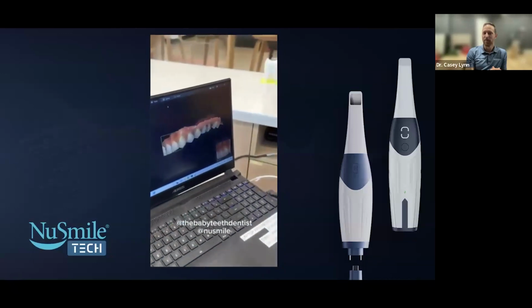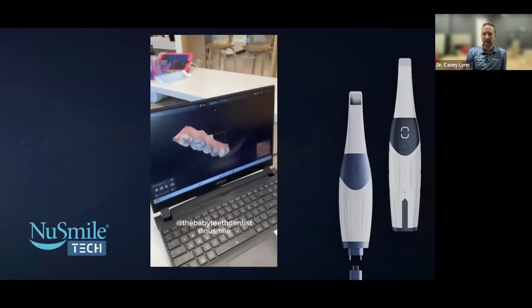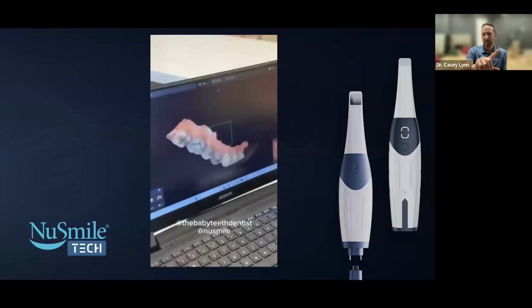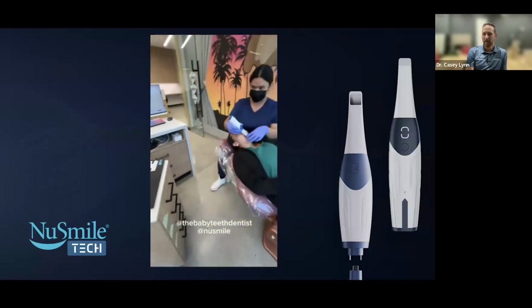And they're just doing what I recommend doing, which is practice on each other. Get that scanning option down. Go back to an already scanned area. See how it turned red, and she just went back a couple millimeters and it recaptured everything, and it just flows in there really nicely.